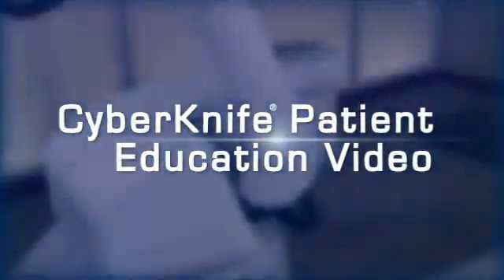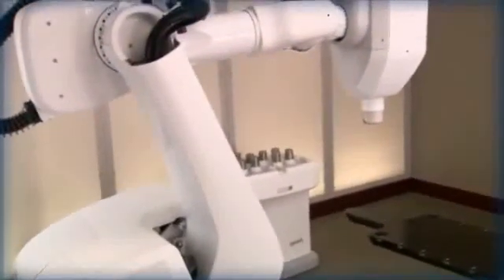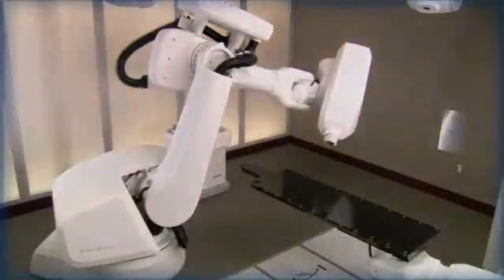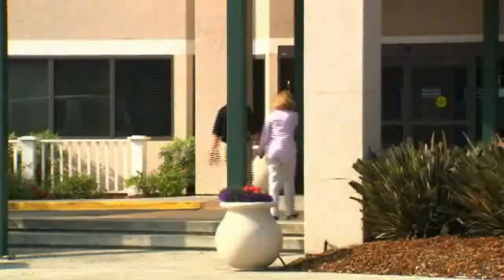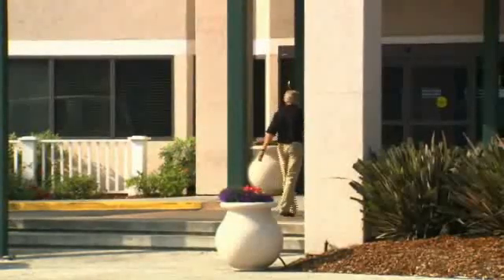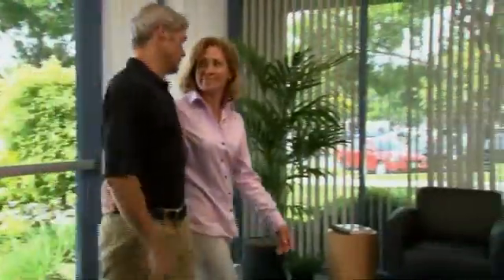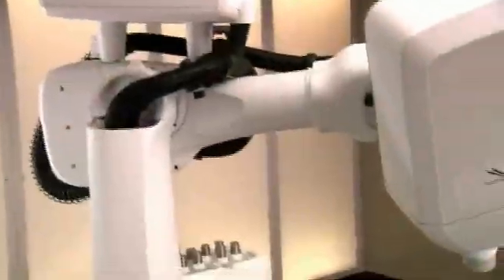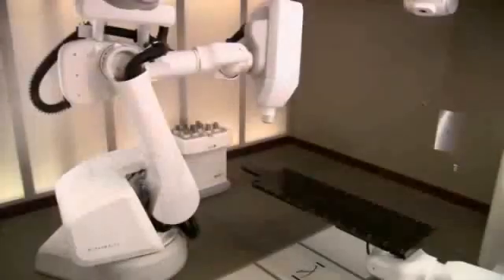Welcome to the CyberKnife patient education video. In the next few minutes, we hope to help you better understand how the CyberKnife robotic radiosurgery system is used to treat tumors and other lesions in the head. We believe that the more a patient and their family and friends know about the steps involved in the CyberKnife treatment, the more comfortable everyone will be with the procedure. The CyberKnife system is one of the most advanced stereotactic radiosurgery systems in use today.